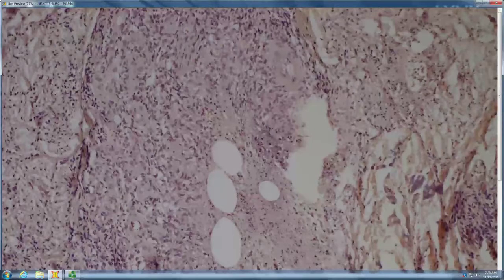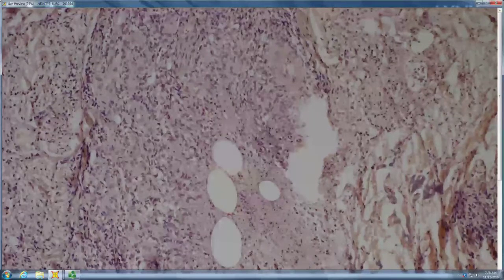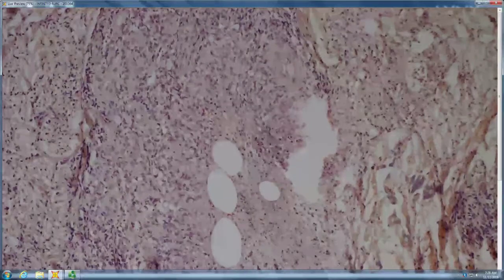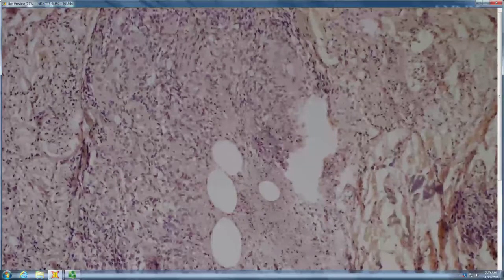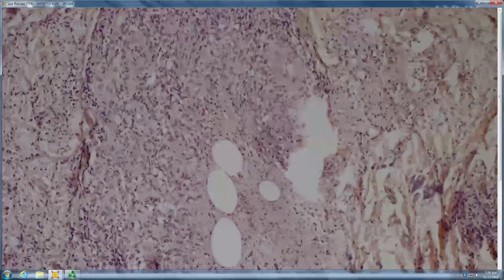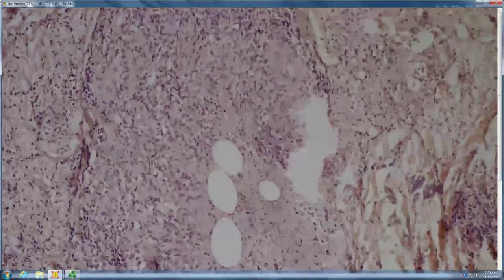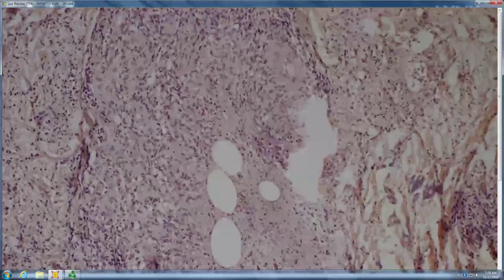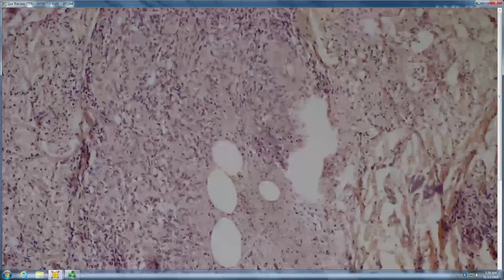What else? You also just think about infections. So you want a biopsy for culture, and culture for anything deep and smoldering is always going to be routine, AFB, and fungal. And you always take it to the fungal desk because they've got to slice and dice it. Over at the routine micro, they grind it up with glass beads. You do that to a fungus and nothing's going to grow, right? So you take it to the fungal desk and they divvy it up and give everyone their bit.